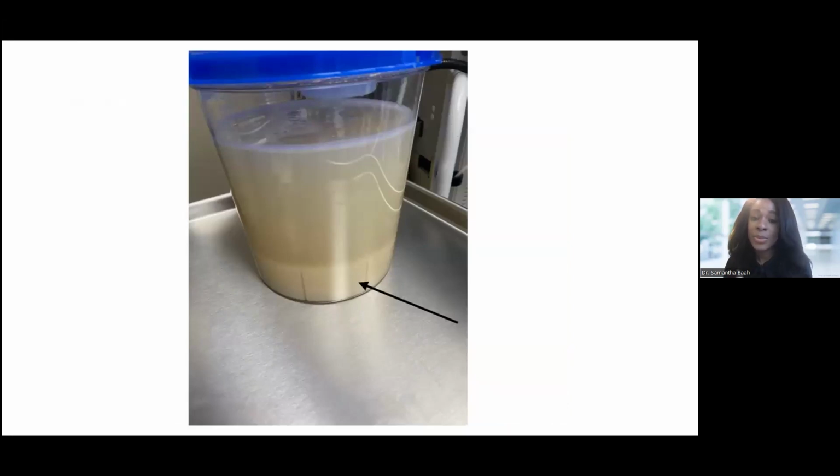And this was his first liter. We did 9 liters of sterile saline into his lungs in this patient. So this was the fluid that we got back, which looks very abnormal. This is not like the regular alveolar fluid that we typically get back, which is mostly clear, maybe a little cloudy. This looks very pale. And as you can see, you have the sediment that goes at the bottom, and that's all the stuff that was in his alveoli, the protein and the fat.